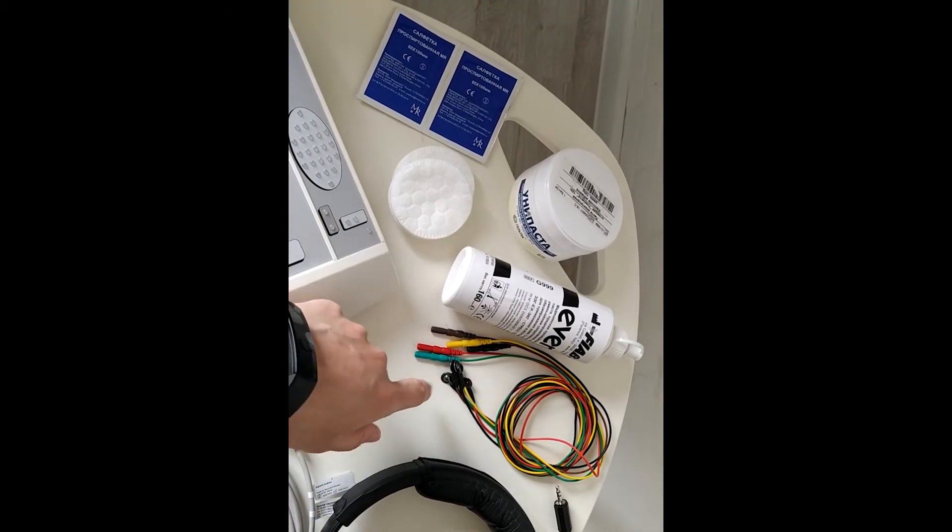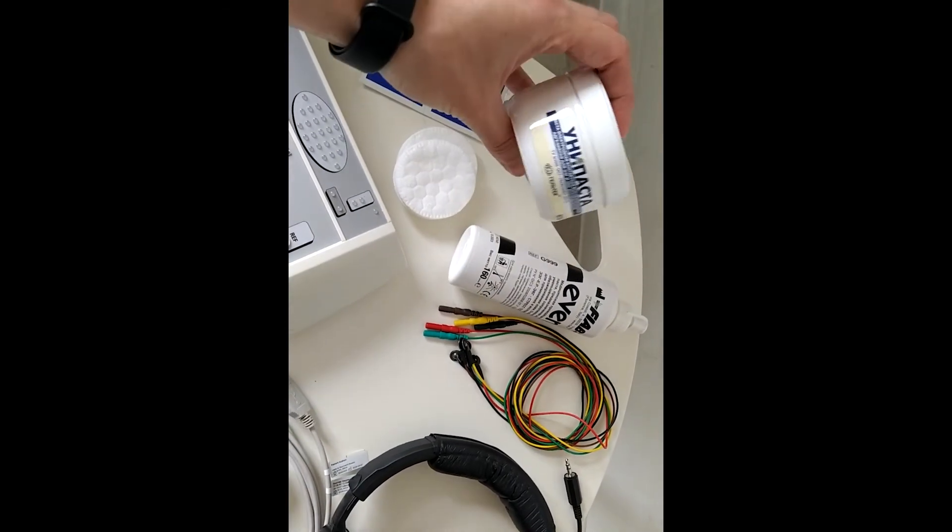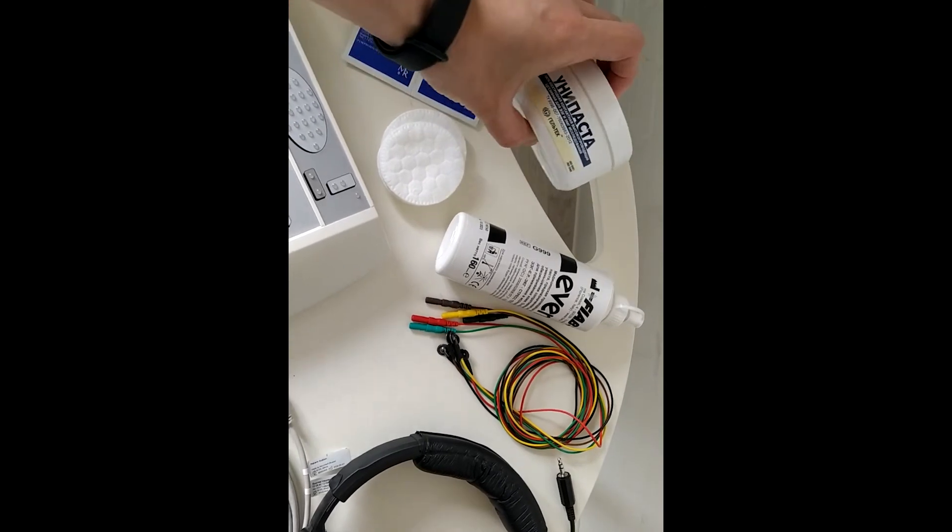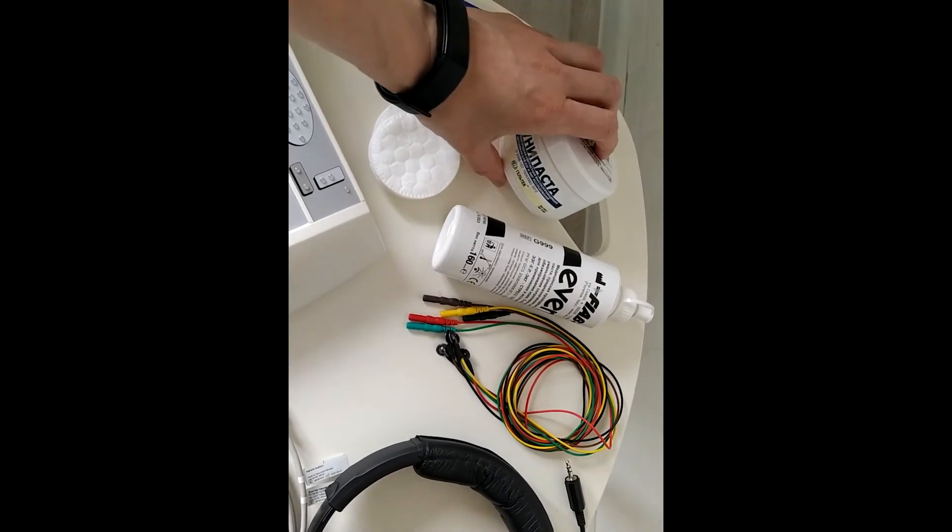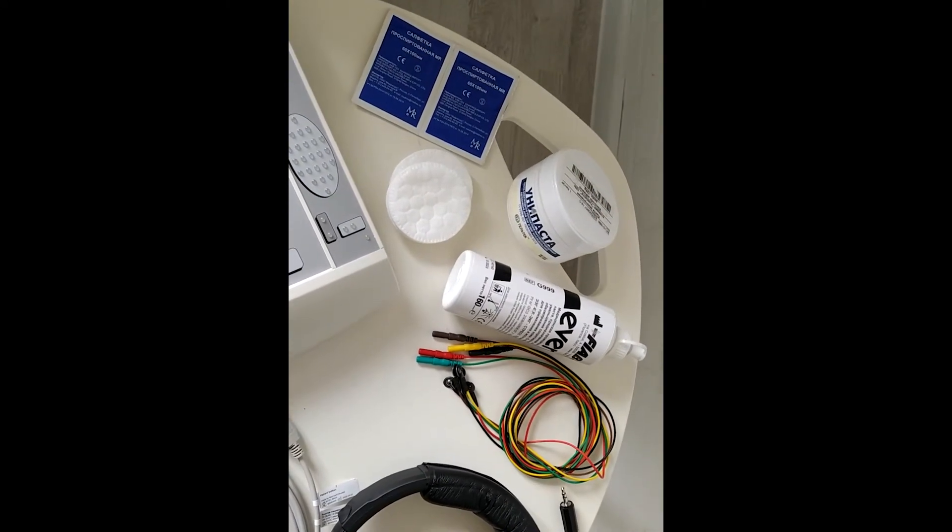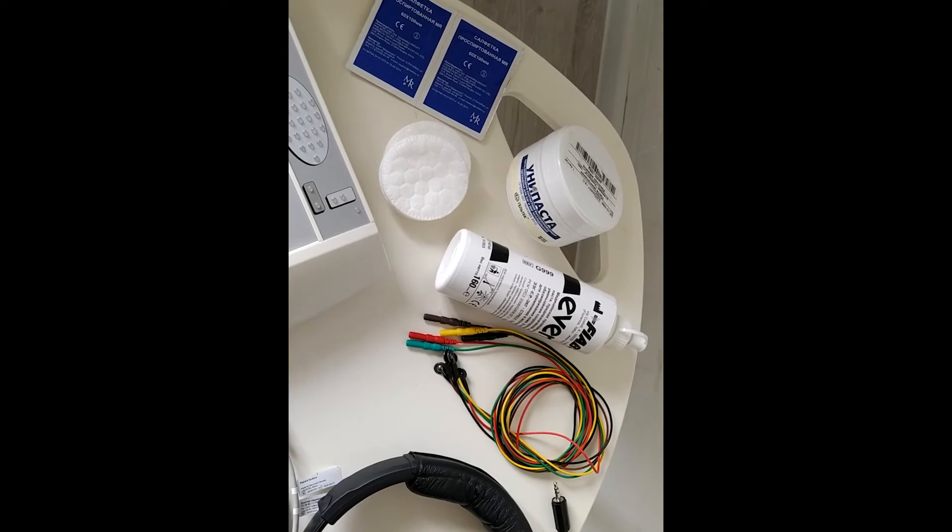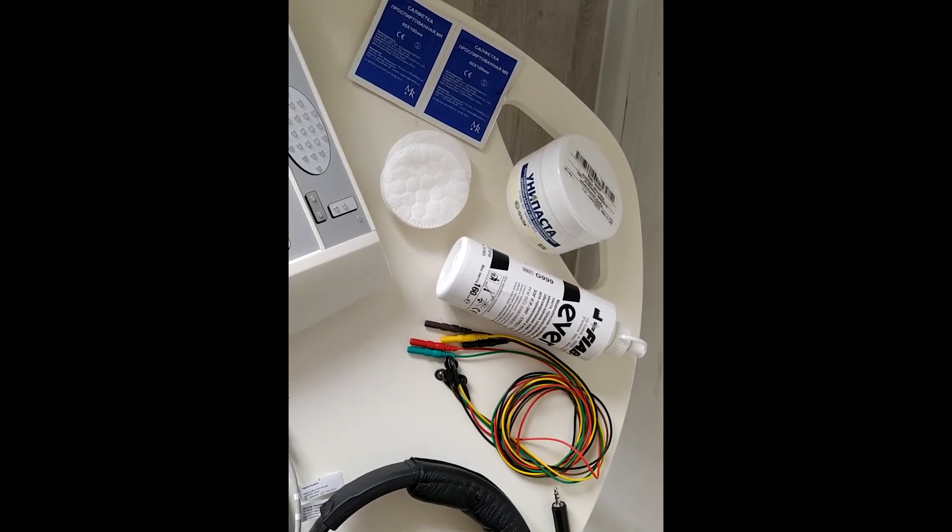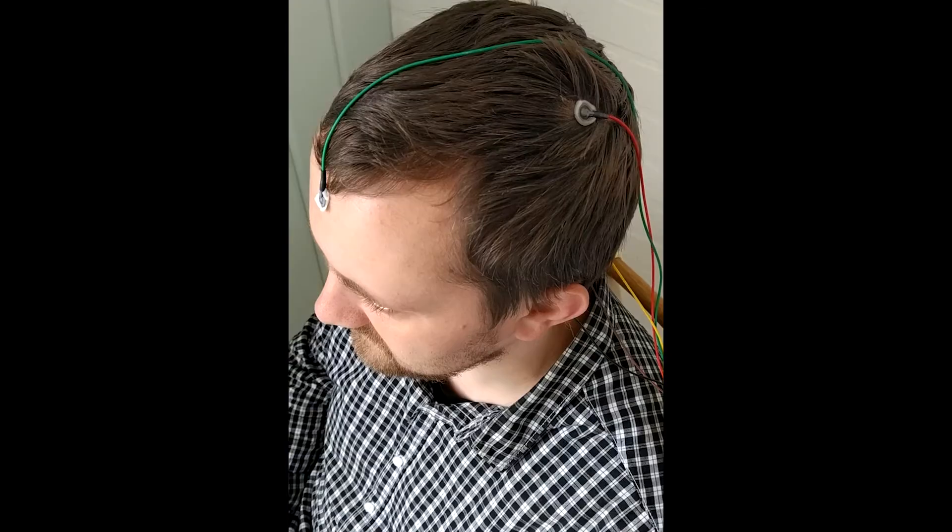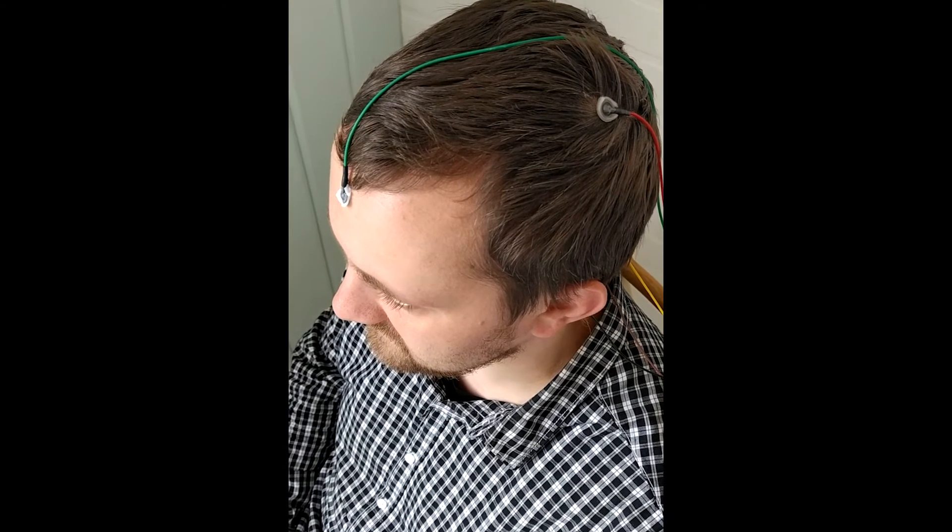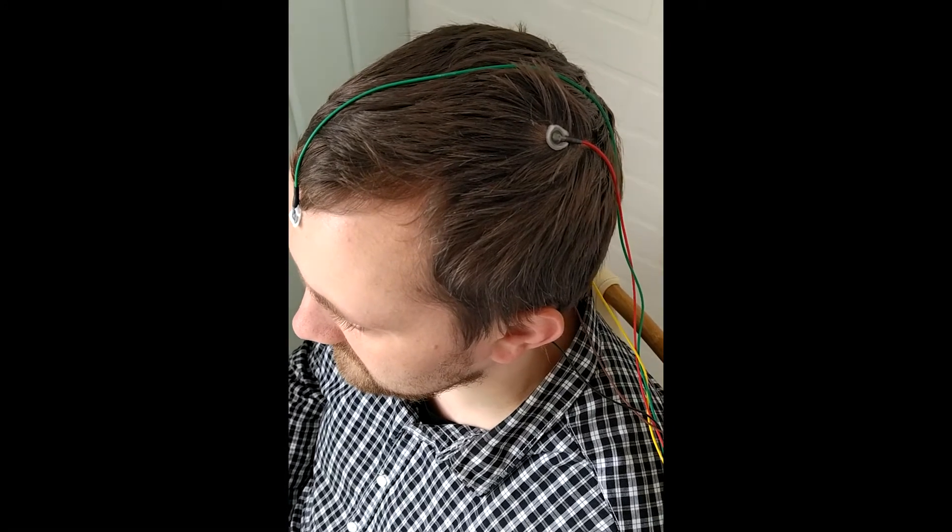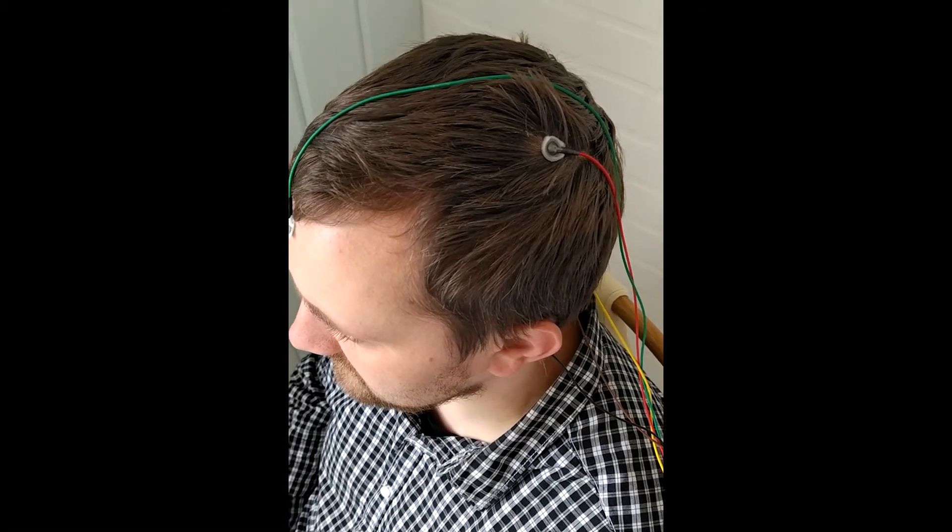After that, we use cup electrodes filled in with adhesive paste and put them on the electrode position. We have prepared the skin and positioned our electrodes.